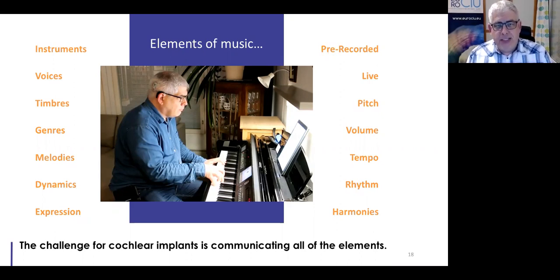Then, thanks to the amazing plasticity of the brain, gradually I have learned to identify notes roughly, but still I do not notice if I hit a wrong note. With 88 keys on a piano and only 22 electrodes in the cochlea, this is hardly surprising. And in terms of what I can hear, rather than playing with my fingers, I might as well be playing with my fist.